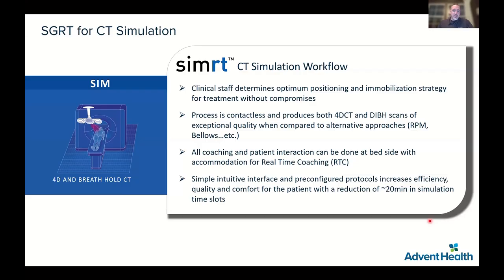All coaching is done at the patient bedside. We felt this was very important because we can provide real-time instructions, real-time visual coaching instructions. There's a visual aid that goes along with the SimRT system. And you can also provide tactile instructions. So if the patient is arching their back, you can interact with the patient much more readily at the bedside, using the in-room monitors and the live feedback that's happening both for the patient and for the person doing the coaching, whether it's a therapist or a CT Sim Tech.